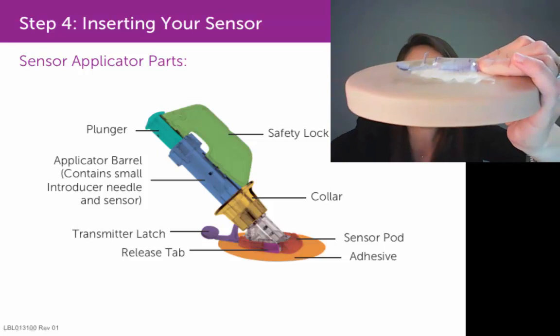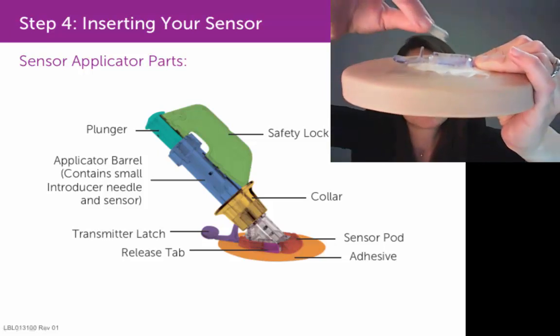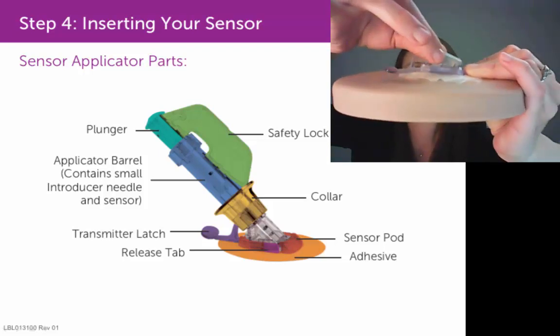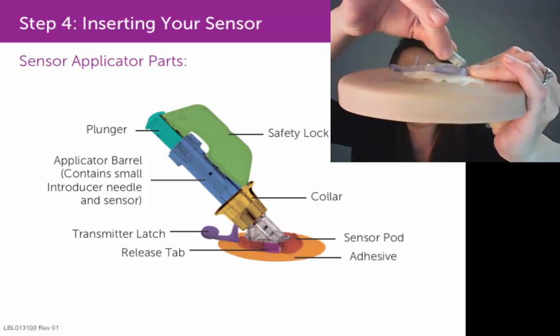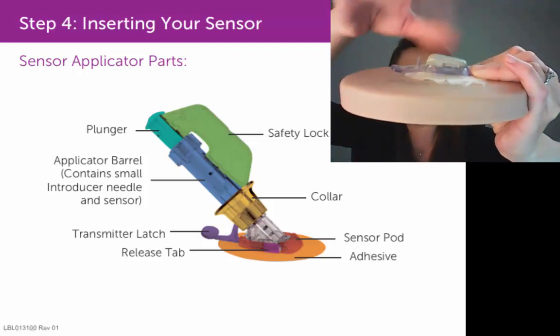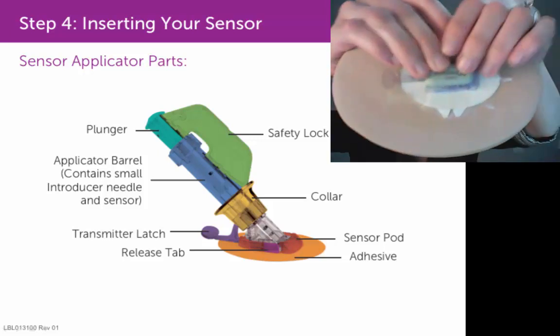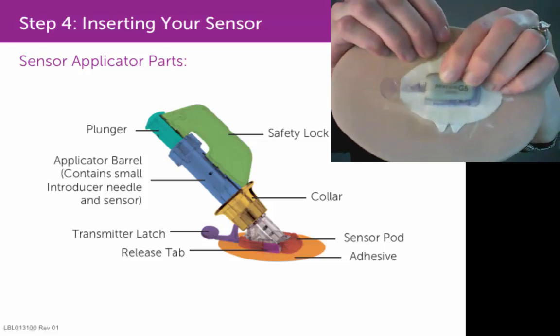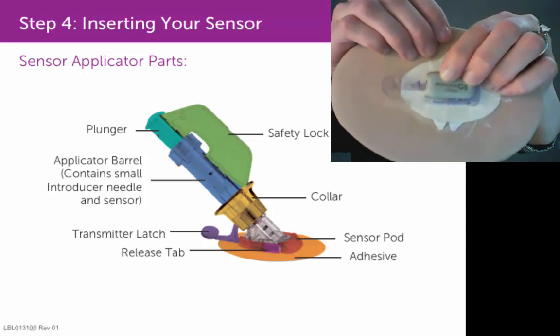Let me show you another angle, because you do sort of angle in that transmitter. Insert that transmitter into the sensor pod on the side opposite of the latch, then just lay that transmitter down so it's resting right on top of that sensor pod. It's not clicked into place yet, so hold it in place with your fingers.